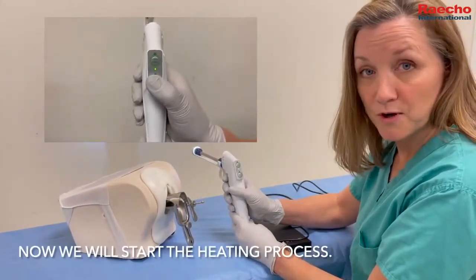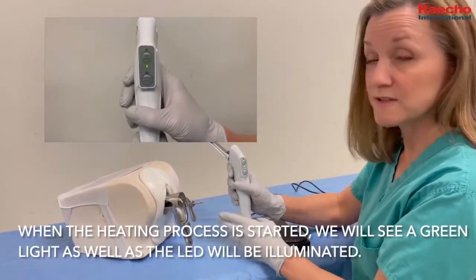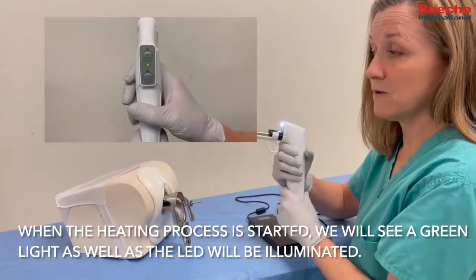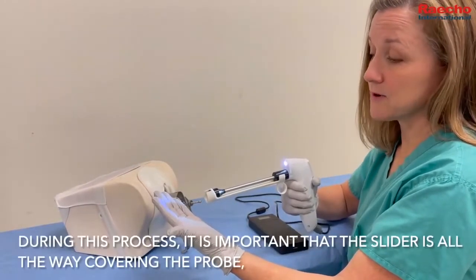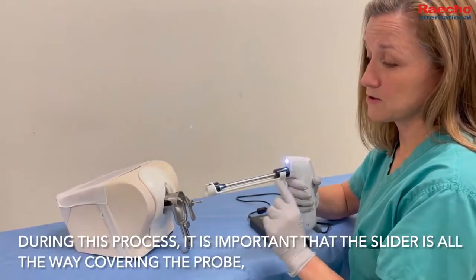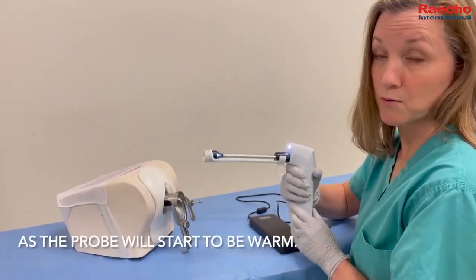Now we'll start the heating process. When the heating process is started, we'll see a green light as well as the LED lights will be illuminated. During this process, it is again important to make sure that the slider is all the way covering the probe, as the probe will start to be warm.